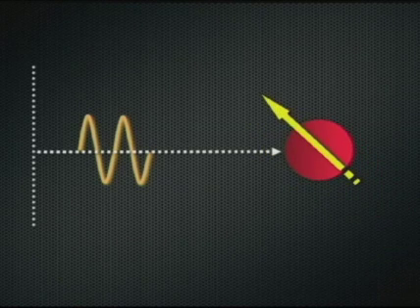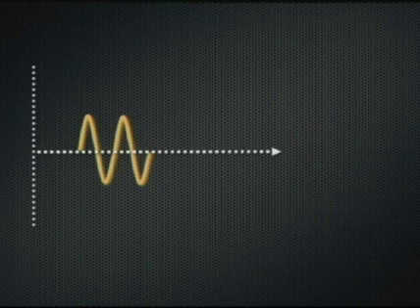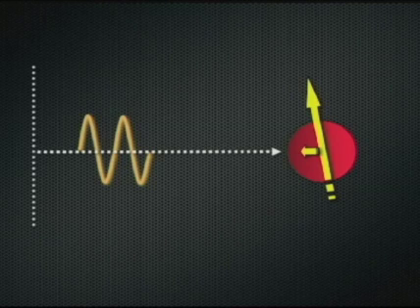As we change the angle, we can see that the relative component of motion towards the transducer and at 90 degrees to the transducer changes. And in a clinical situation in which the transducer may be at a fairly large angle with respect to the blood vessel, a relatively small component of motion is directed toward the transducer, and most of the motion is directed at 90 degrees.